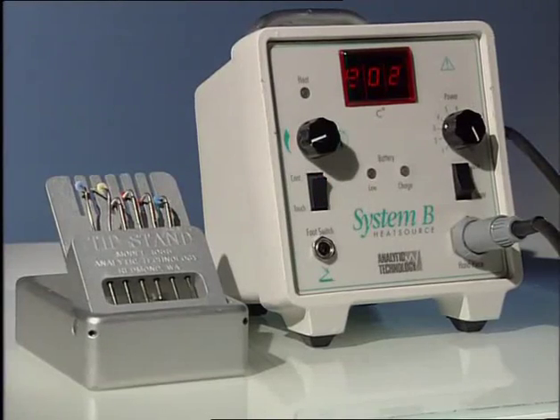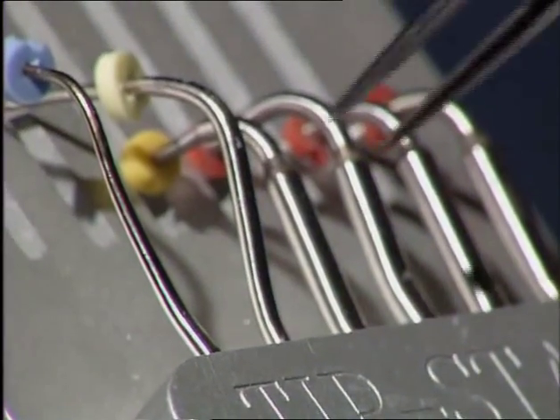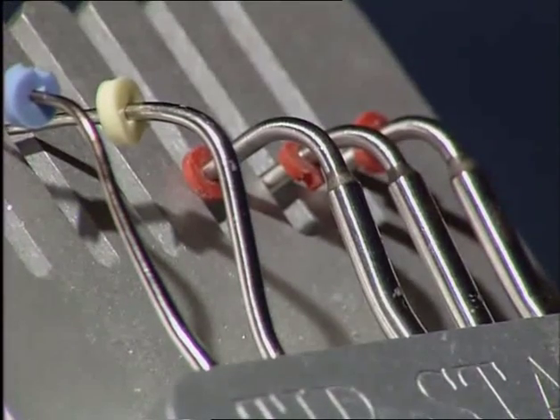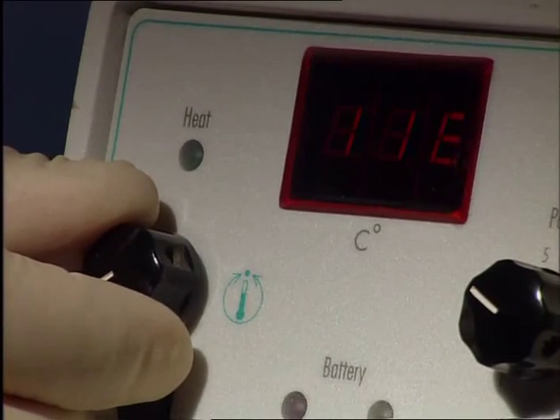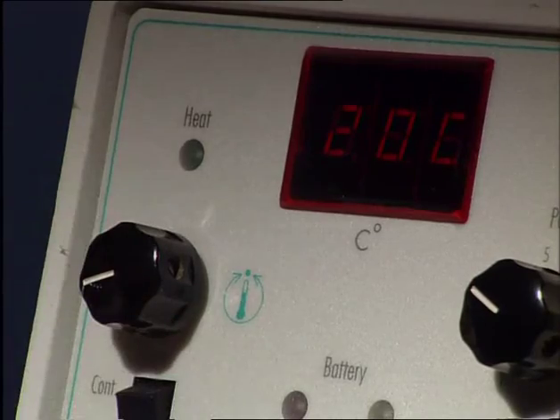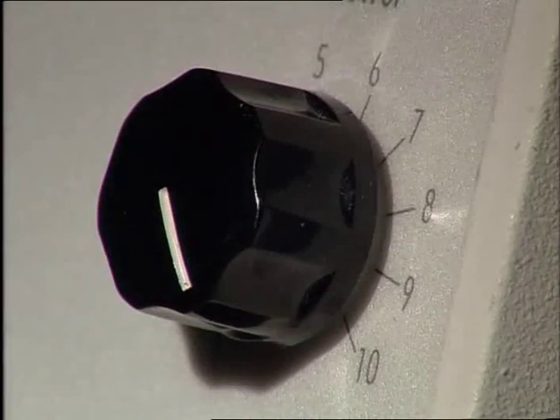An alternative to the downpacking of the classical Schilder technique was the development of the System B. With the help of the so-called Buchanan plugger, the gutta-percha is simultaneously heated and condensed. The largest plugger is selected, which can be fitted to within 5 to 7 millimeters of the canal terminus without binding on unyielding dentinal walls, and the stop is adjusted. The System B heat source is placed in the touch mode and set to 200 degrees Celsius and used at full power on grade 10.